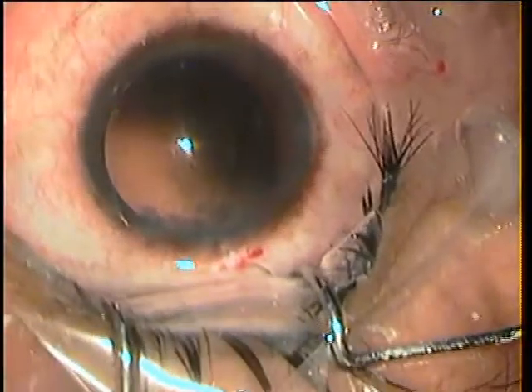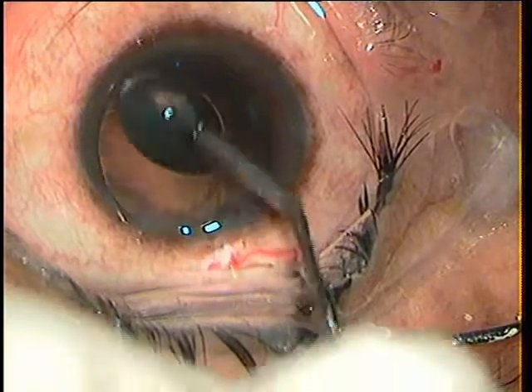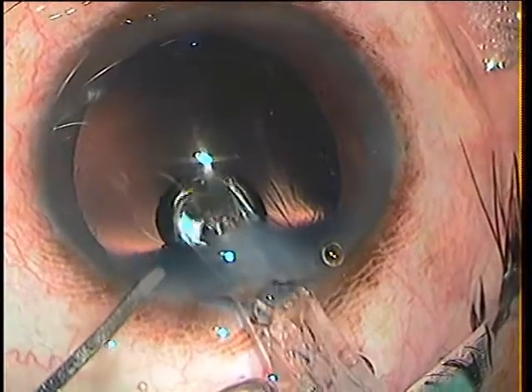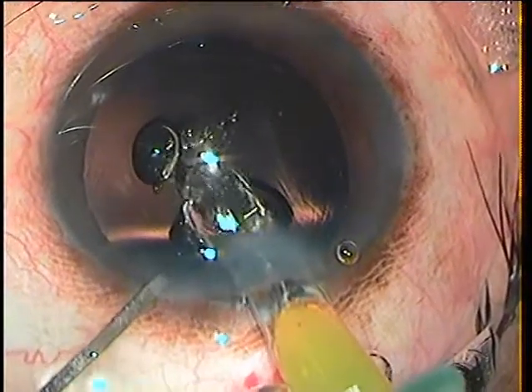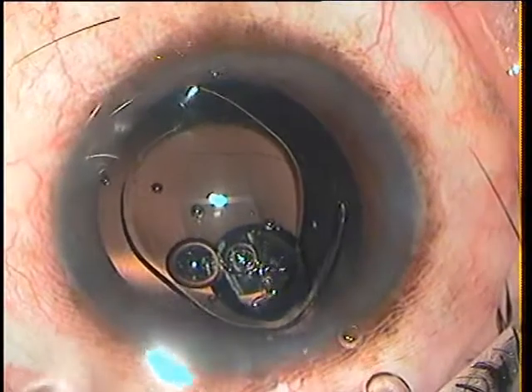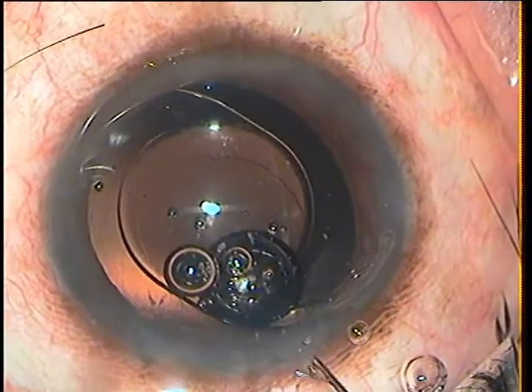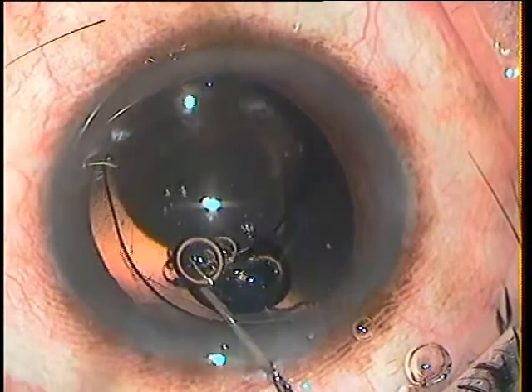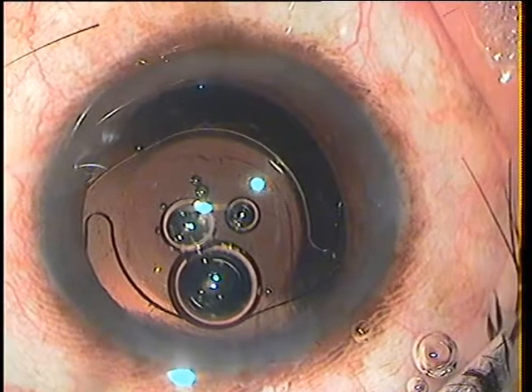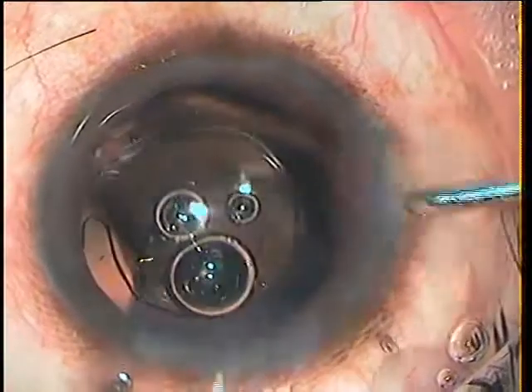The rest of the procedure is routine implantation of another lens. Apart from the dent in the pocket of the surgeon, the biggest concern was not to create a dent in the posterior capsule — and in that I succeeded. I am implanting another similar lens. Both haptics are fine. The leading haptic is drawn into the bag, and I tuck in the trailing haptic into the bag. I feel a sigh of relief having faced no complications in explanting and re-implanting the lens.